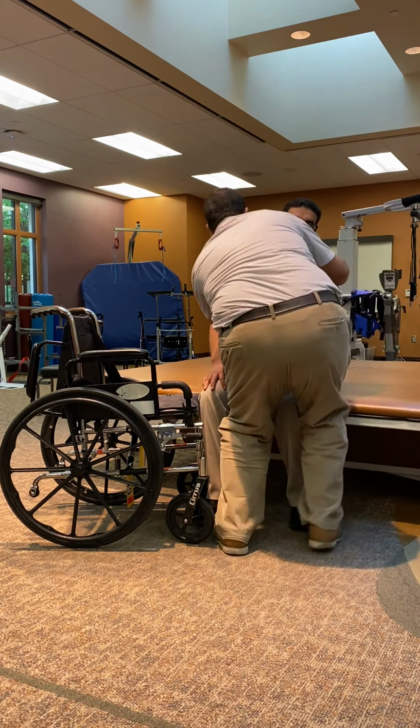You're going to fix your feet. Fix this one forward like this. That's great. This foot is going to be swiveled like that. That's awesome. I'm going to do the transfer right now. We're going to get to the wheelchair, okay?